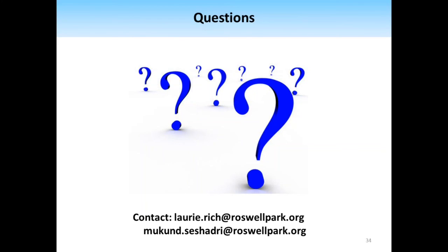I think we could answer that question by increasing the treatment, making it more clinically relevant, and increasing the number of times that we're imaging, maybe doing multiple imaging sessions during the week. That will help us identify the most important time point for figuring out when this tumor stopped responding or didn't respond.